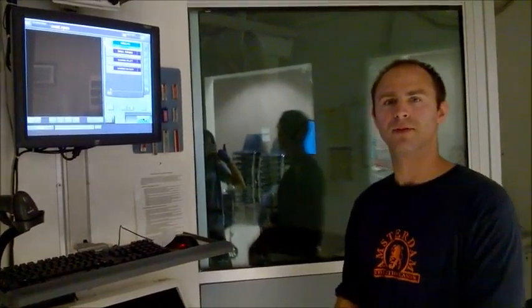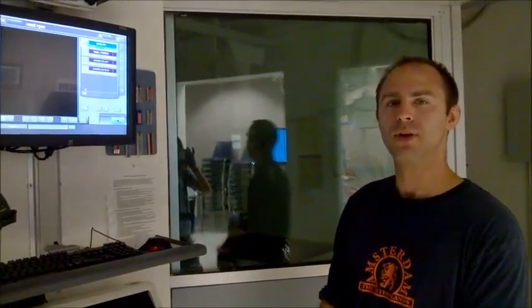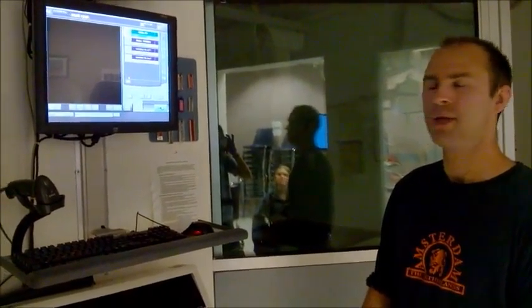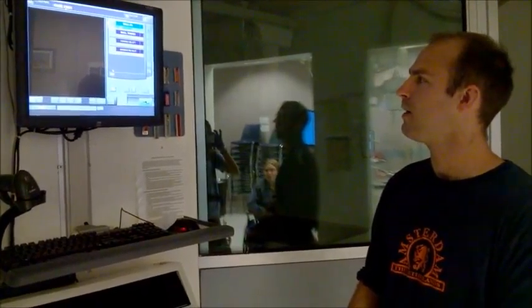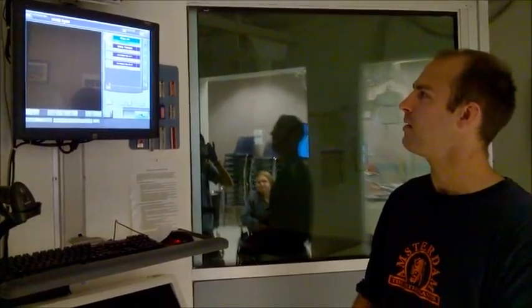Ready? Okay, my name is Ben Scolati. I just got an order in from the doctor to do a mandible series. So I put into the computer a PA mandible, a Townes exaggerated mandible with a 40-degree caudate angle, and a left and right oblique lateral mandible. And I put in my patient's first name, last name, and date of birth.